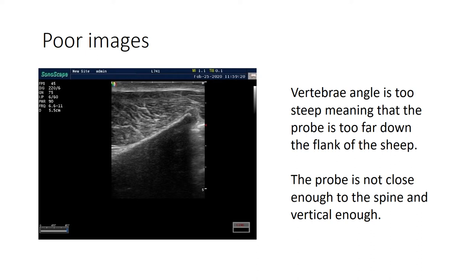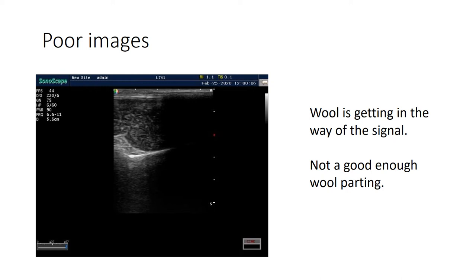Here's an example where the probe has moved down the flank of the sheep - it needs to be closer to the spine and more vertical. You can see clearly that the image isn't as level as it should be, which will distort the shape of the image. And here's a classic image where there's a problem splitting the wool - some wool is influencing the contact, or there's a lack of oil between the probe and the skin - giving you a blackout where you can't see the image. Take the probe off, re-split the wool, apply a little more oil and you'll get your image back.